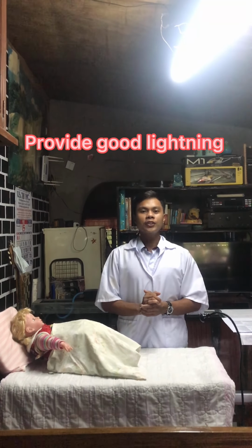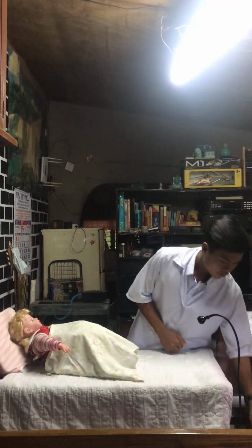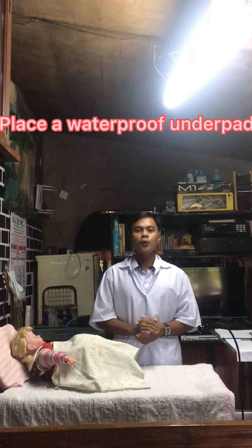Next is provide good lighting. Good lighting is necessary to locate the meatus clearly. Provide privacy by screening and closing the doors or windows, and the client has the right to be protected from exposure to others. Place a waterproof underpad under the client. This protects the bed linen from moisture and from getting soiled.